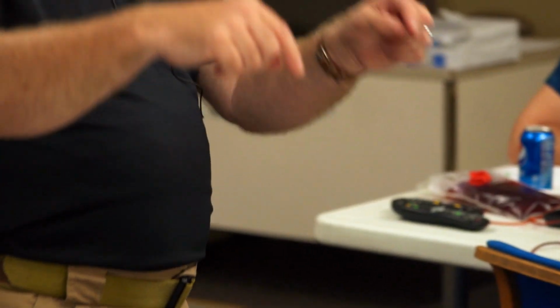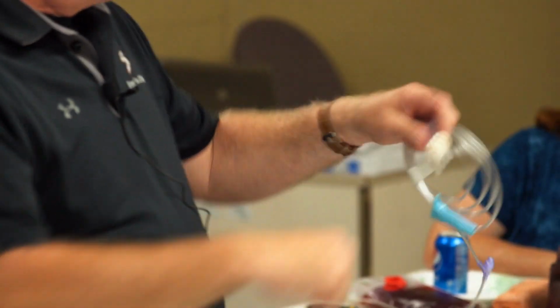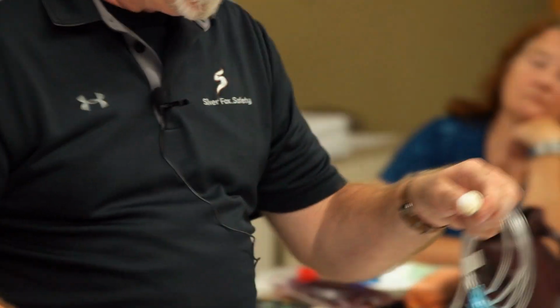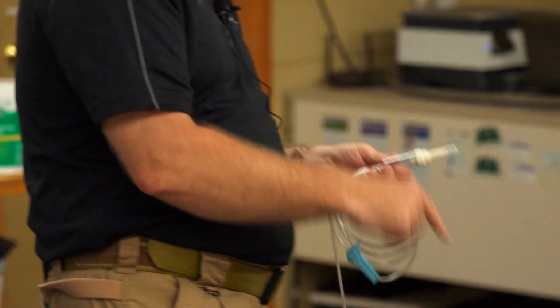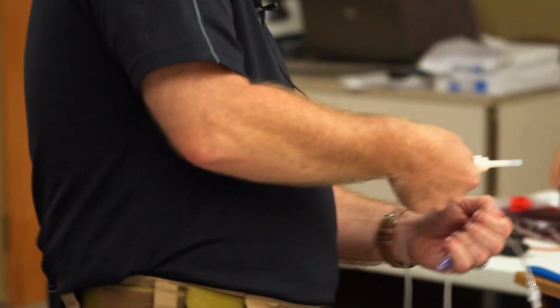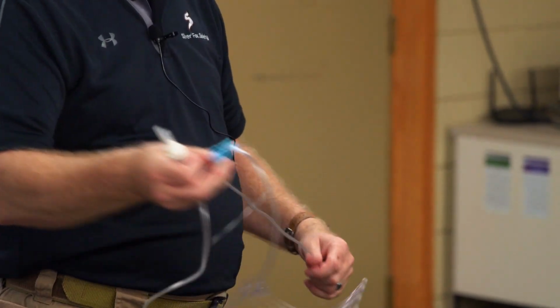And then when we're doing this particular piece under the cap into here, we don't want to touch that. So once we take this cap off, knowing where that's at and being aware of going into and spiking your bag, not letting that touch anything else, because this is sterile under here and it's going into sterile here, we really want to minimize our chances for infection. So things like that, and when we start opening up catheters, how we're maneuvering them, and your placement, we're going to get into that, where sometimes we go over the thumb, you have to change your technique. So we don't want to introduce any more icky, germy thingies on there. That's a really good technical term, right?